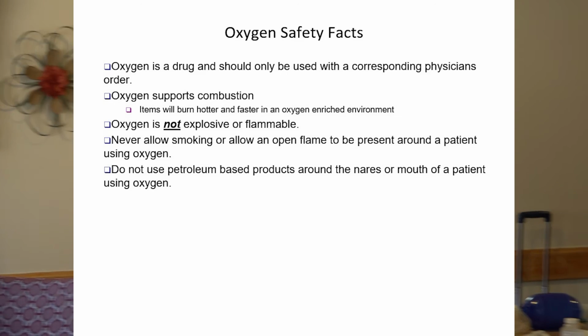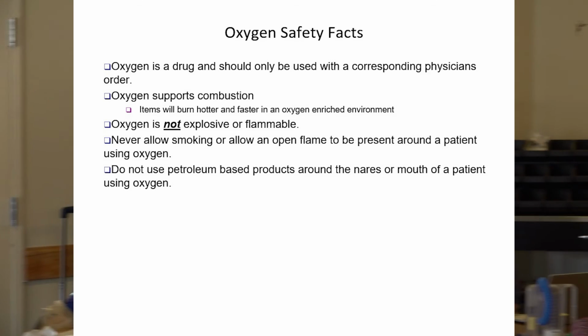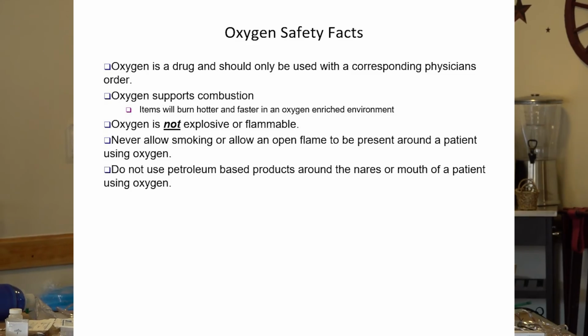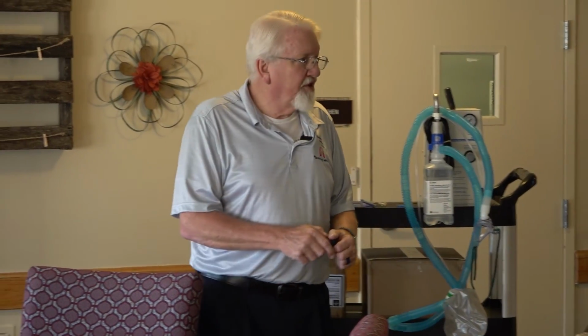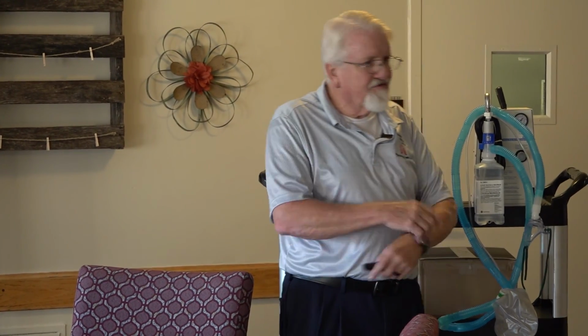Oxygen. It is a drug, so make sure you have an order in place for the FiO2 or the liter flow that you're trying to maintain.